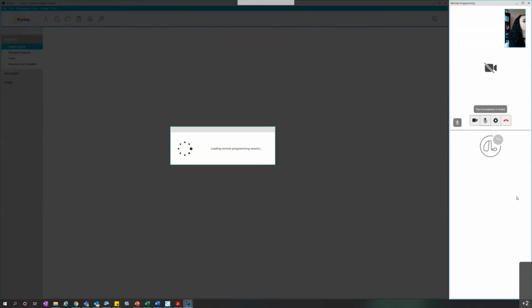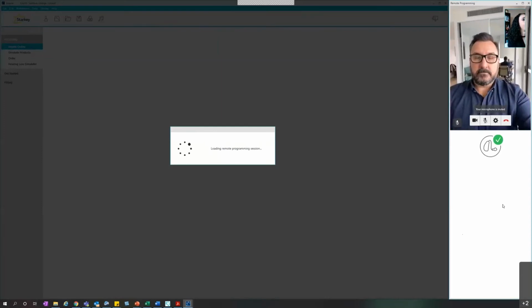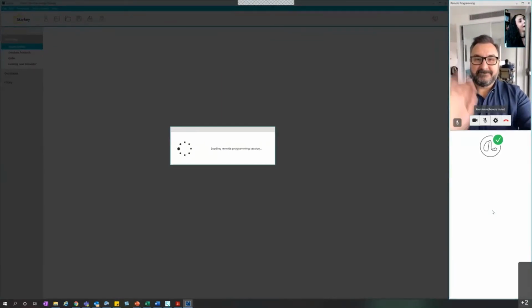I'm just going to mute my Hearing Care Anywhere microphone so I don't have feedback from the recording. So now I can see my patient, Mr. George Vincent Santana. Hi, Mr. Santana, how are you today?